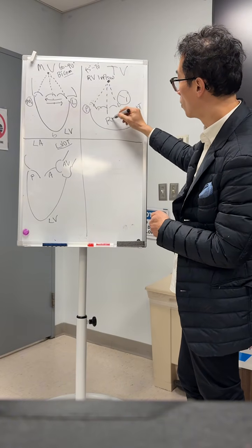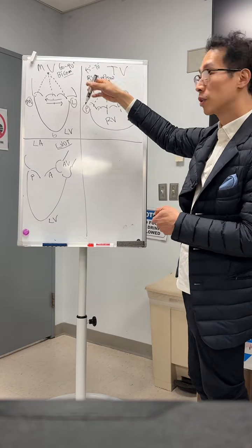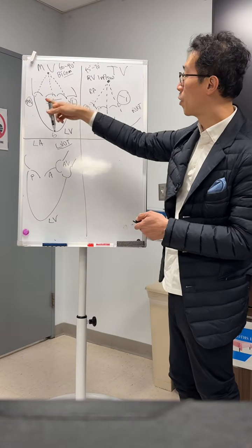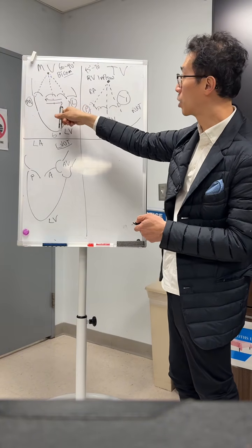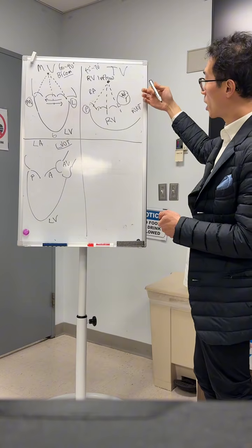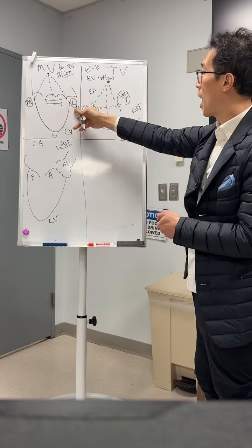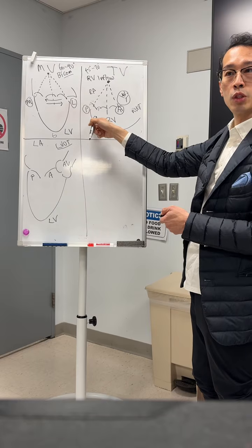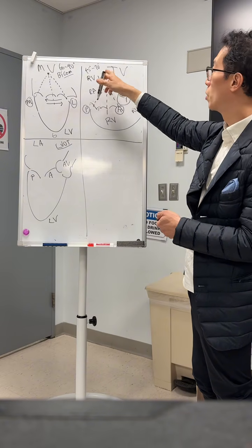Does that make sense in terms of the similarity? So this is the working view for mitral: bicommissural, intercommissural view, lateral, medial. You can sweep either way to interrogate the valve. Make sure the apex is 6 o'clock. Here, you want to shift the aortic valve towards the right side so your beam encompasses the entire tricuspid valve. So now, lateral becomes anterior, medial becomes posterior, and this is anterior septal sweeping towards posterior septal. So this is the inflow view.